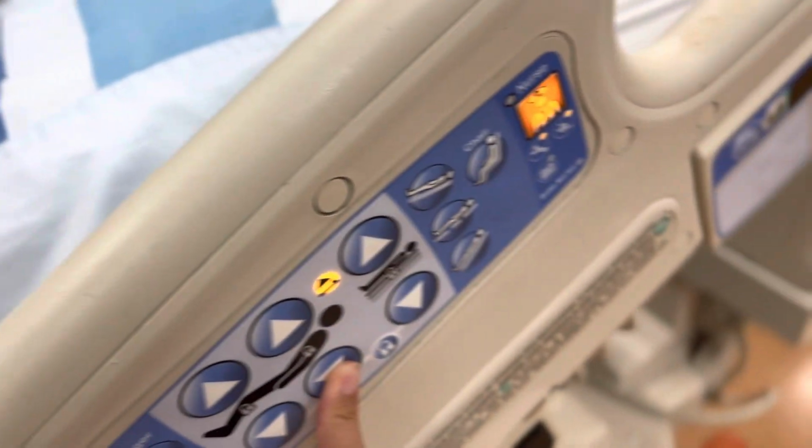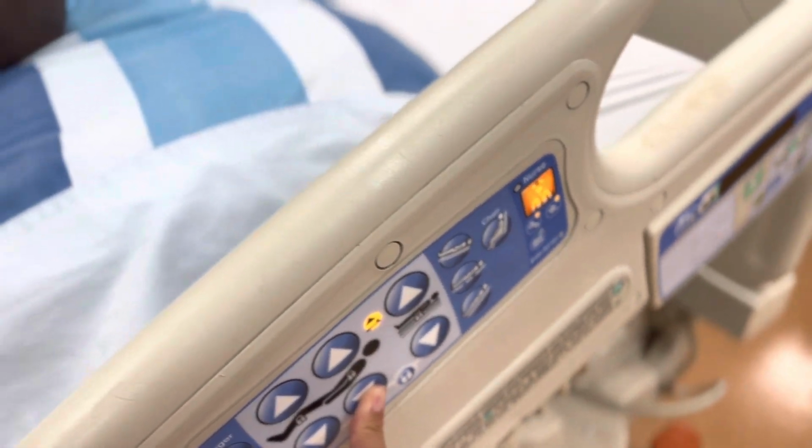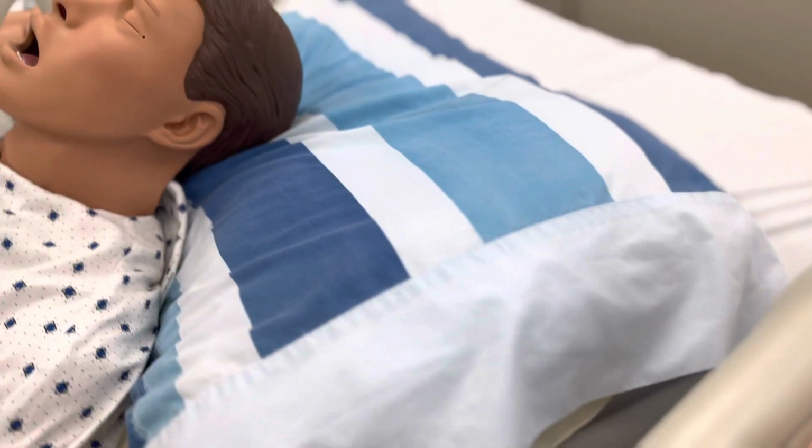Remember to remove your gloves, perform proper hand hygiene, and thank your patient for being cooperative.